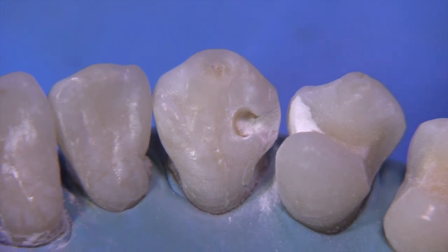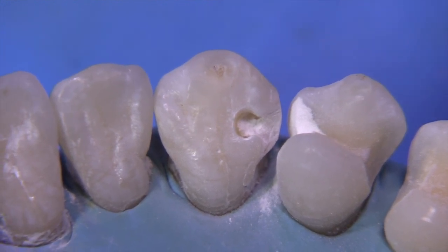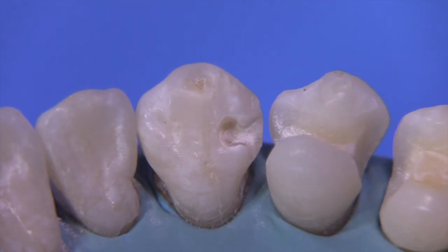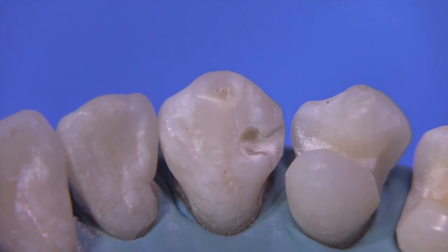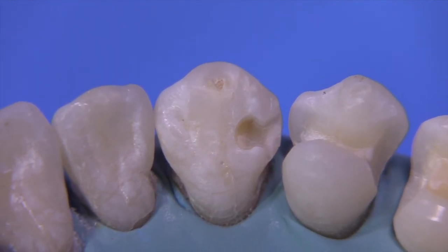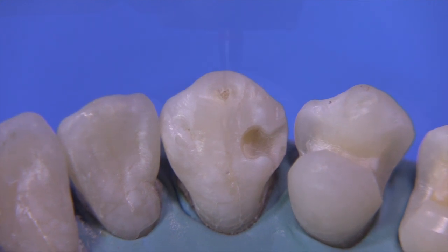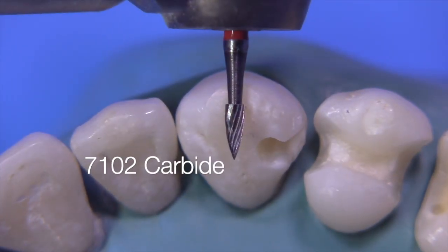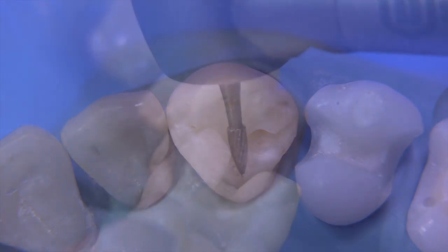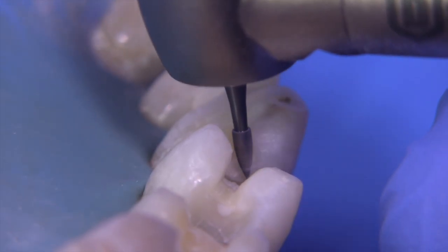Once you've got the flares and the proper depth and draw, you're now ready to look at dealing with this interproximal area. We're not going to place a box — we're going to use a hollow grind like we just did on the previous project. In order to do that, we're going to start out with a burr slightly smaller than the 7404, the 7102, which will easily get between the teeth and we can start the hollow grind procedure.